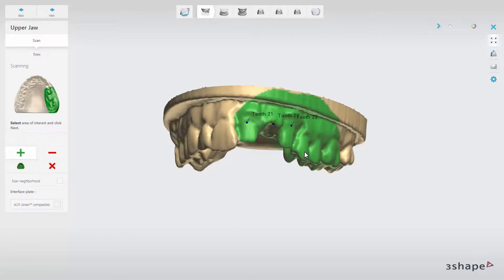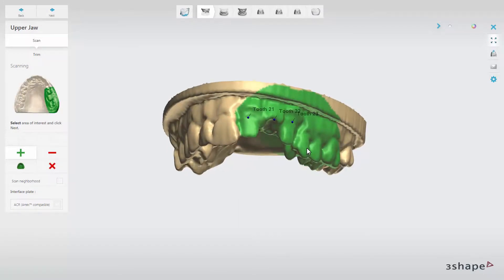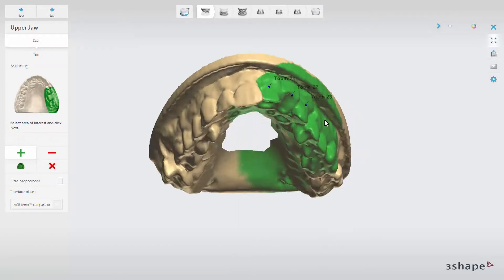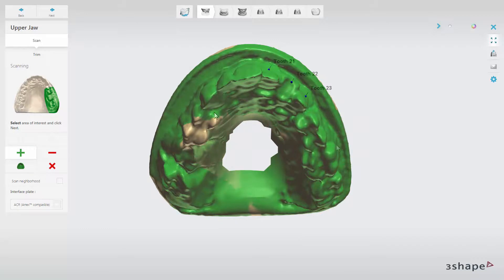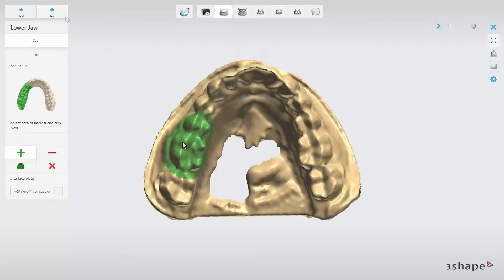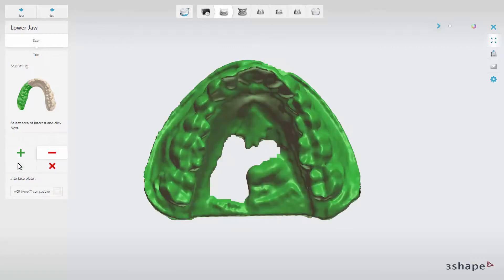First, scan the upper model. On the initial scan, set an annotation and select the area of interest and click Next. Select the area of interest on the lower model and click Next.